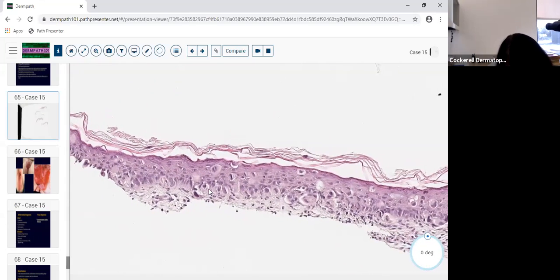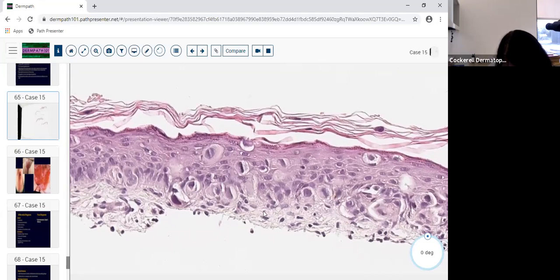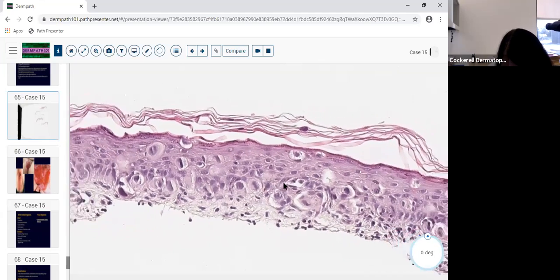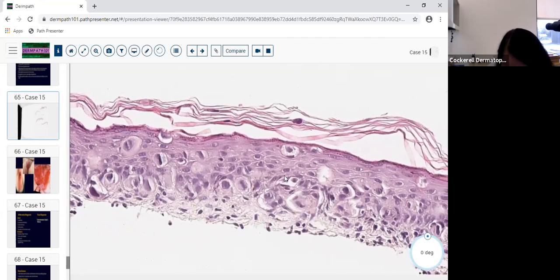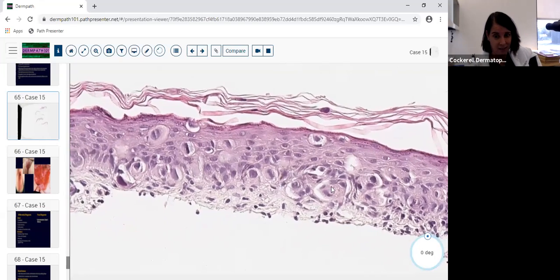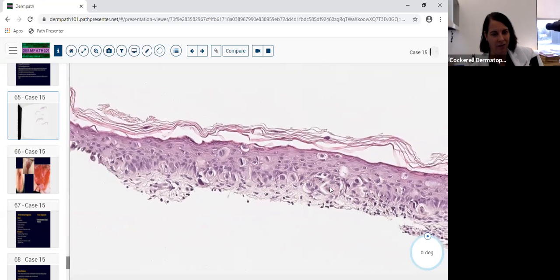Do I see melanin in these cells? Look for melanin. Now there can be some melanin that just sort of gets in there. So, like right there, wait a minute, is that melanin? But you'd see more melanin than that if this was a melanoma. Can a melanoma have a prominent nucleolus like that? Cell in the middle, yes. So melanoma is my differential here, and I think I've thrown Bowen's out on this.